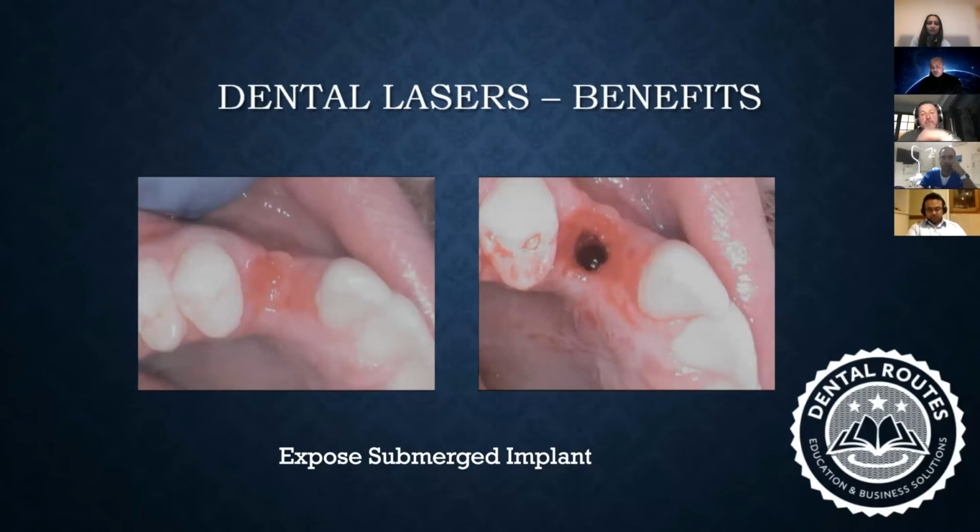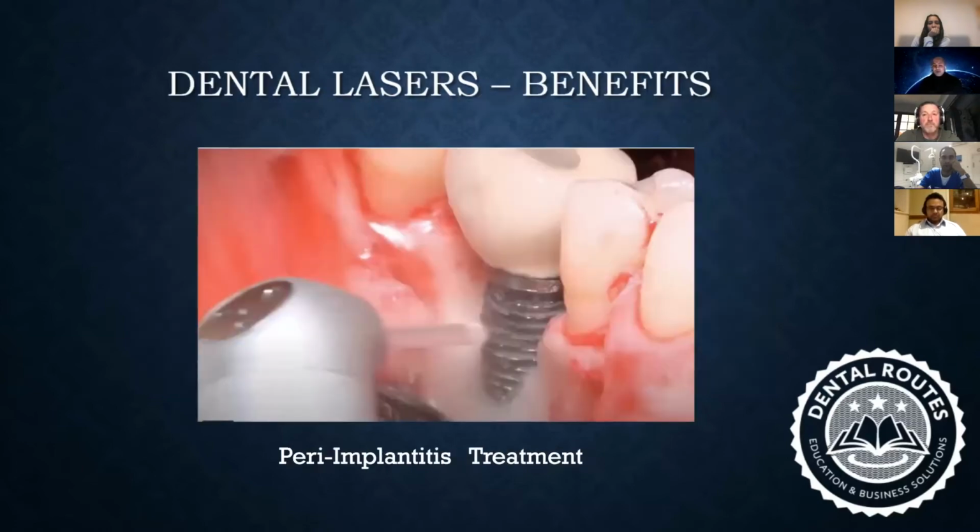And especially if you're doing a provisional crown and so on and so forth, that's all done in the same stage. And you have another big advantage of using a laser here as against your traditional method of incision and exposure. Okay, that's the next stage of where I use it.